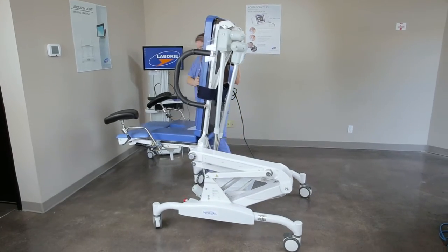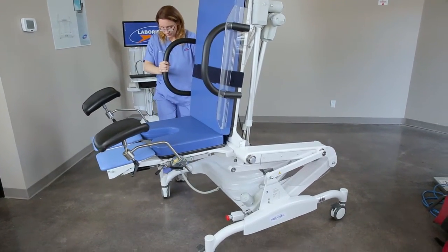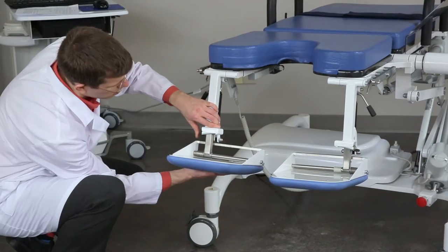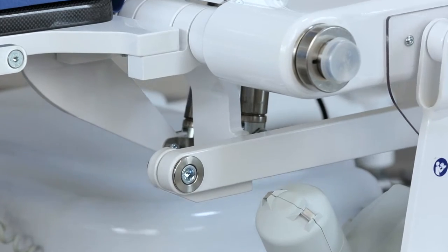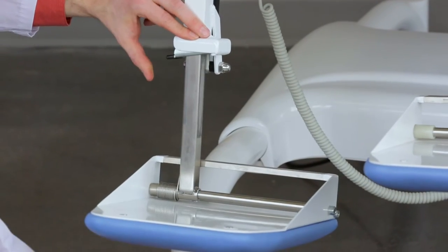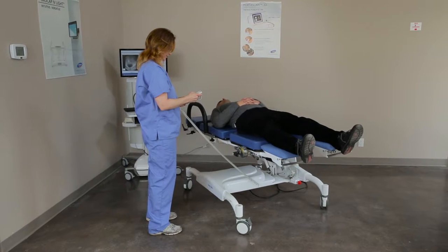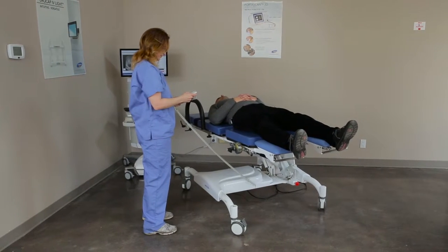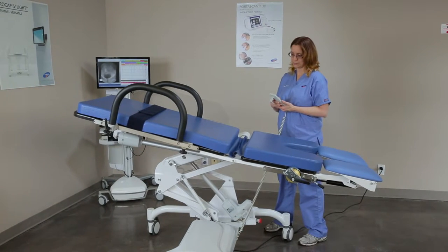The chair should always be in a lowered seated position, with the footrests folded up to allow the patient to sit down. The footrests can then be lowered and the chair raised for use. The length of the footrests can be adjusted to suit the patient. The chair can be converted into a fully or partially supine position table, and the angle of the table can be adjusted into full Trendelenburg position.